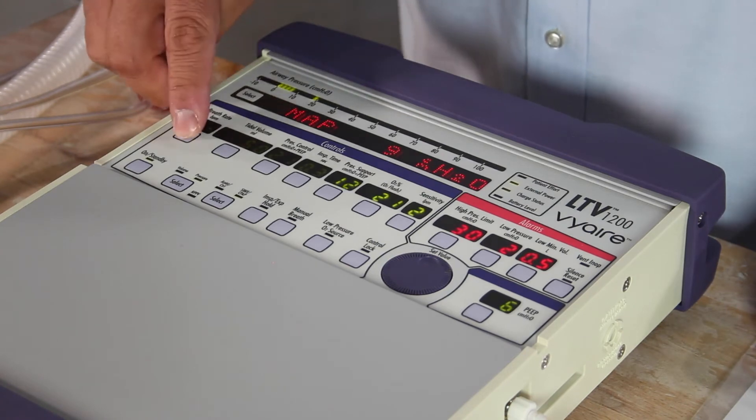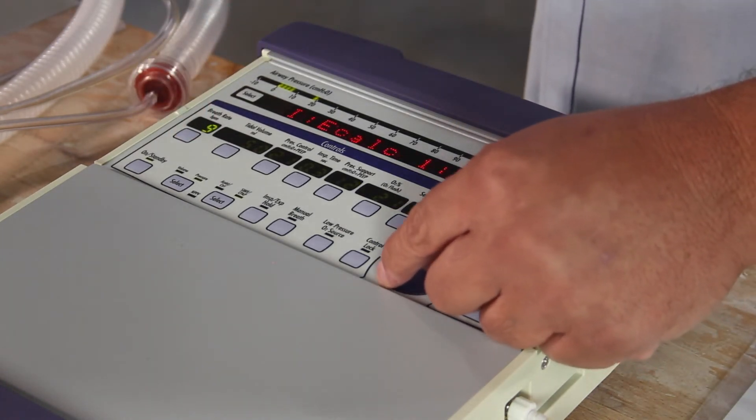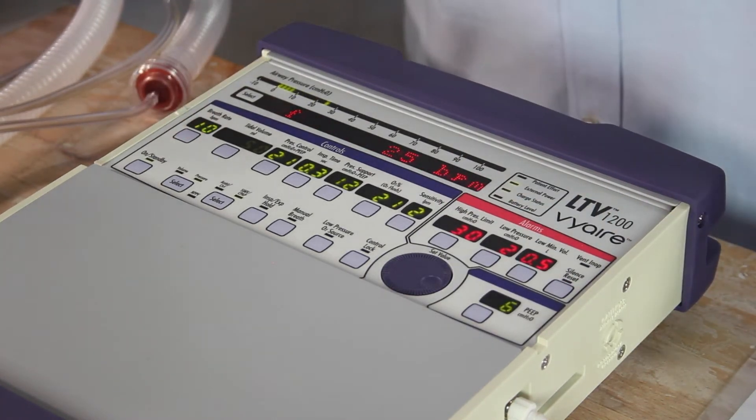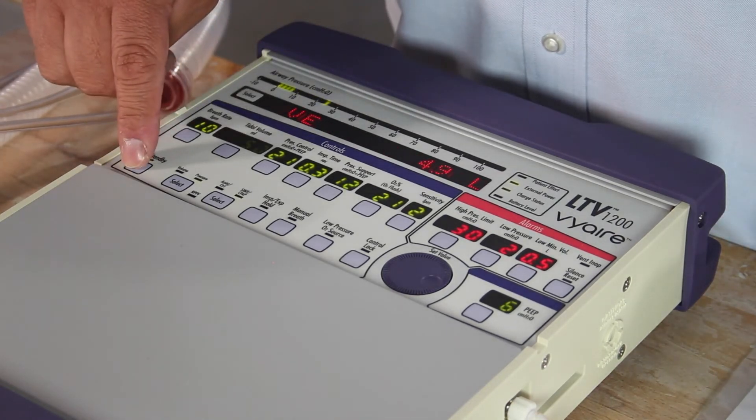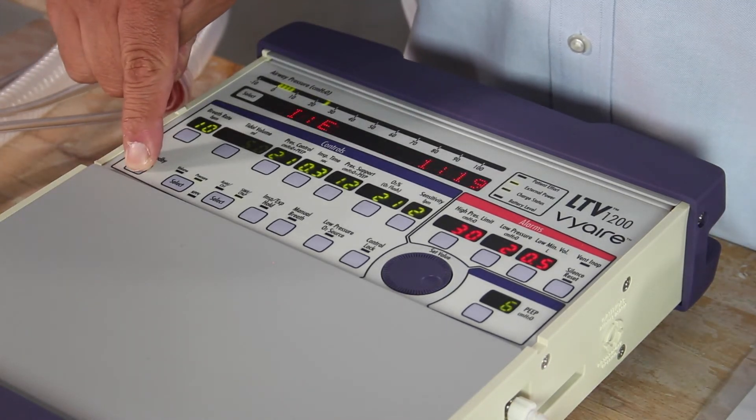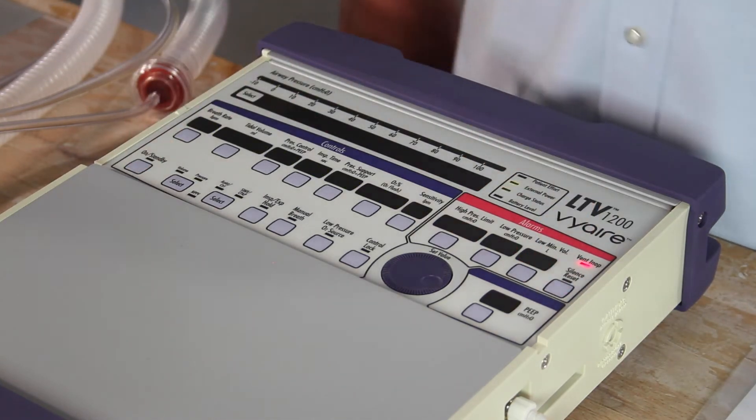Let's go ahead and get out of that mode of ventilation by simply pressing a rate and put a breath rate of 10. We're now back in an SIMV mode of ventilation. I'm going to go ahead and shut the ventilator off. Hold the button down three to five seconds. Silence reset.